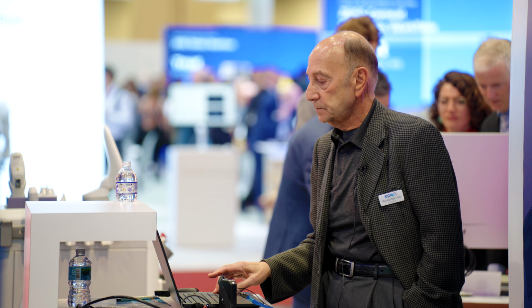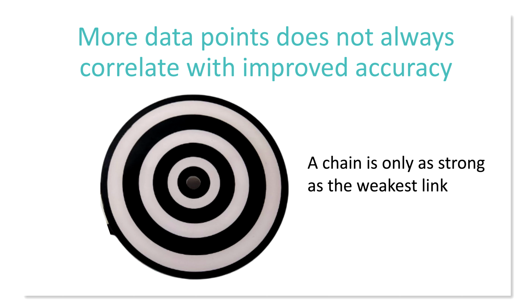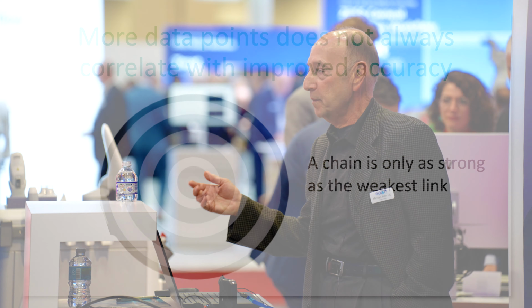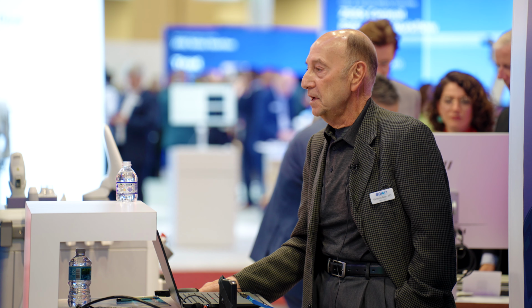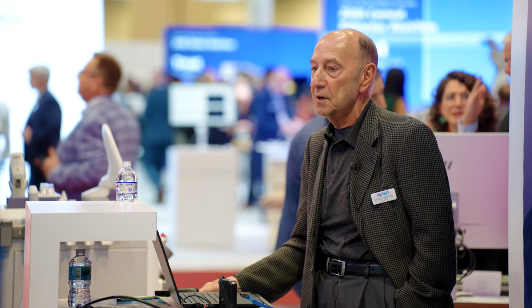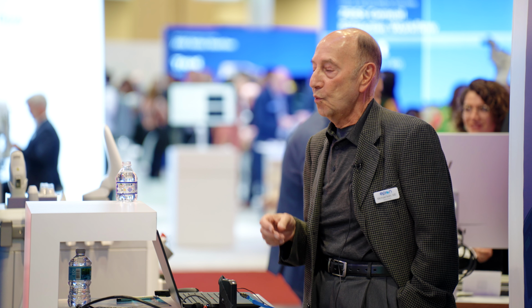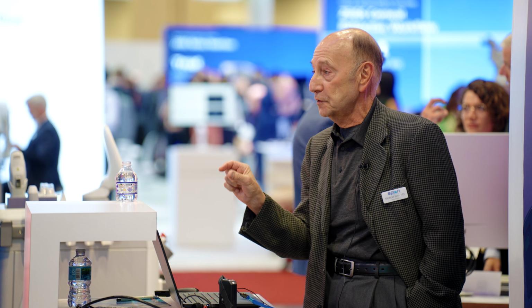Okay, and I always go back to way back many, many decades ago when Placido systems first came out and they were automated, and different companies kept telling you, well, we have 20,000 points in our Placido, we have 100,000 points, but that was somewhat meaningless because the weakest link was not the number of points to put on a single circle, it's how many circles there are.